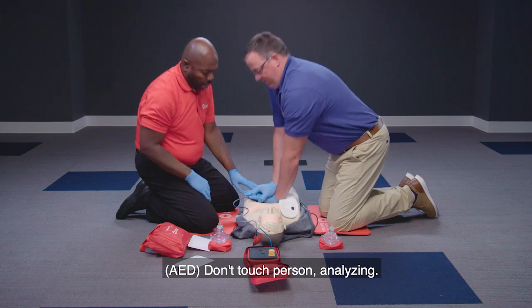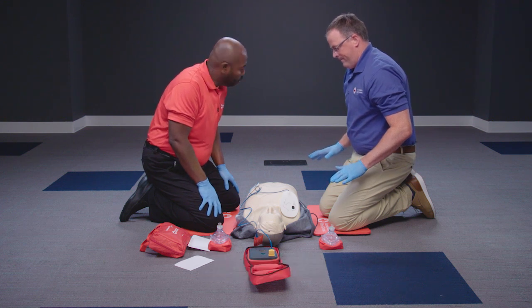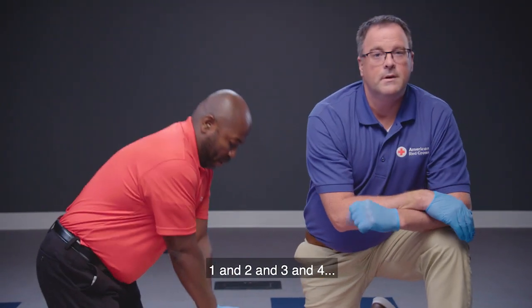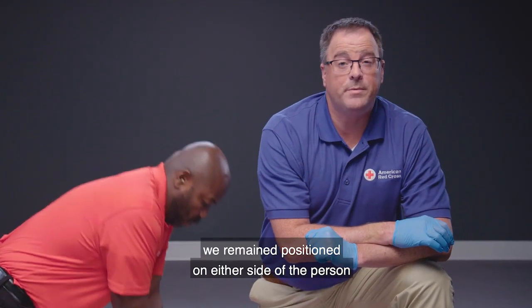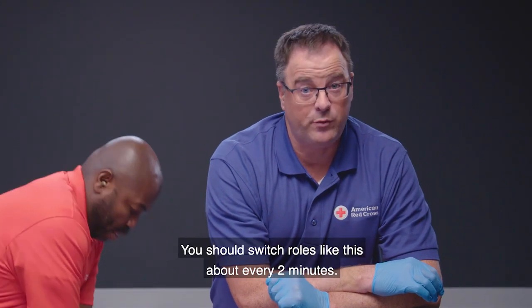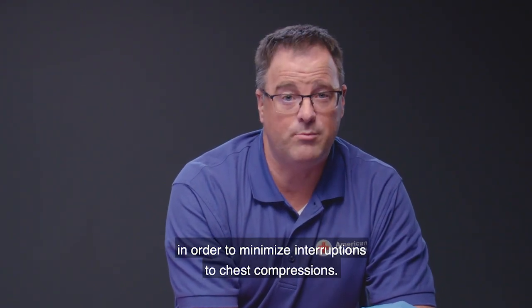The AED instructs 'Don't touch person' while analyzing. The responder calls out 'Clear.' After shock is advised and the shock button is pressed, the shock is delivered and CPR resumes. After the shock, the responders switch roles, remaining positioned on either side of the person with the AED at the person's head. Role switches should happen about every two minutes and take less than 10 seconds to minimize interruptions to chest compressions.